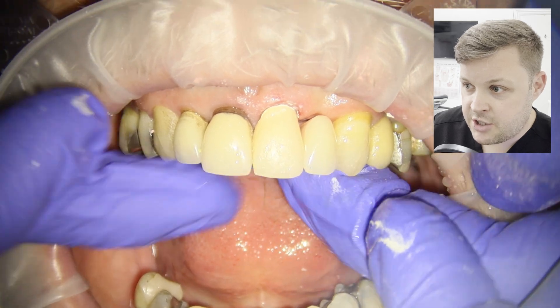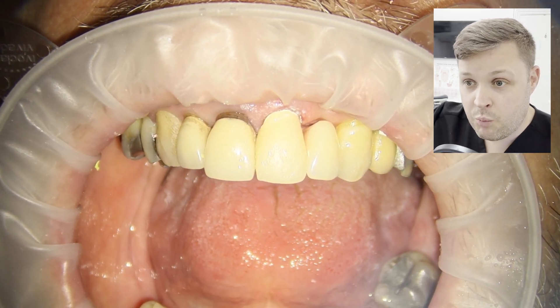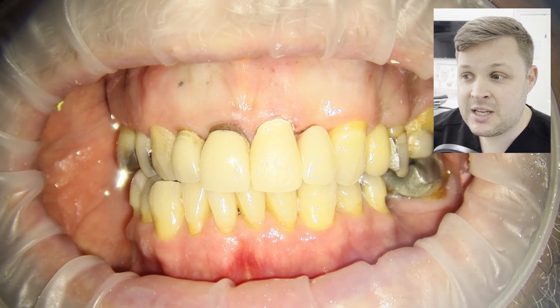We place the denture back in, and that looks really nice. The patient can go away now and live their life for two weeks — it looks perfectly fine.